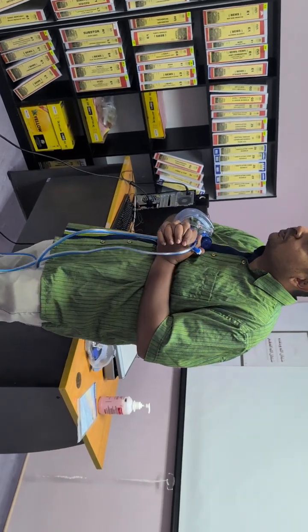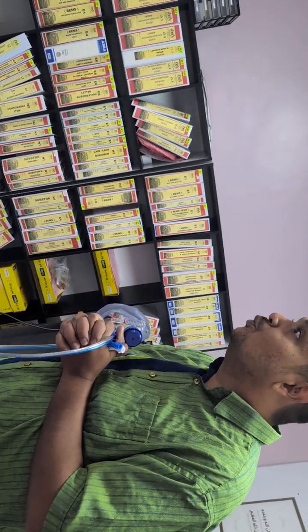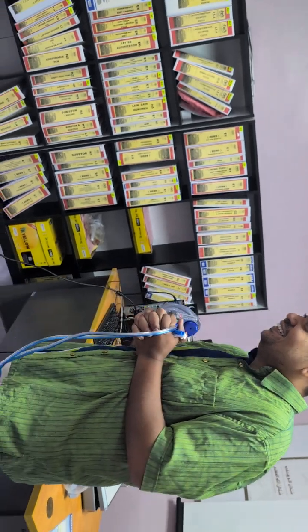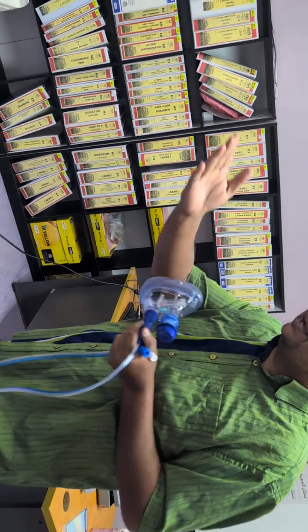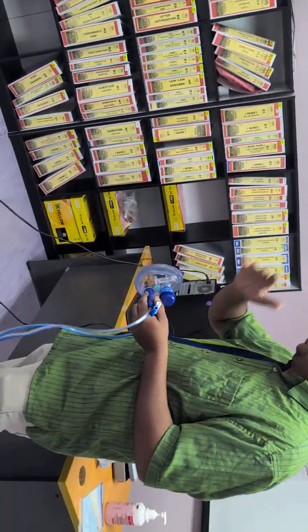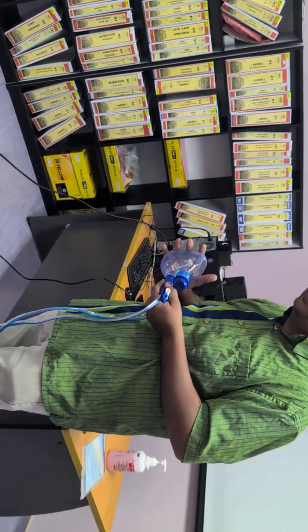How do you wean off the patient? How do you send the patient down for CPAP in the ward? You don't send the patient with machines? You just send them with a venti mask. This is good, because some hospitals do actually send with the machines, and by the time the machine comes back up, you're not even sure, because not everybody knows how to operate the machine.